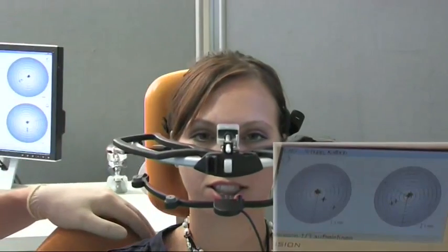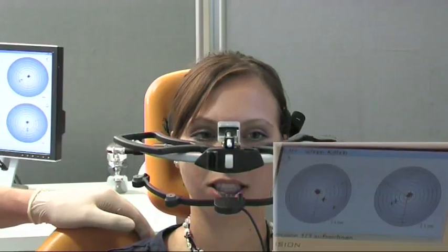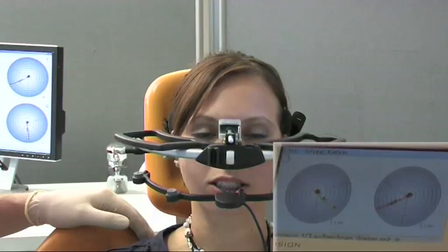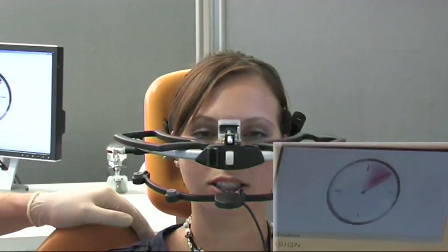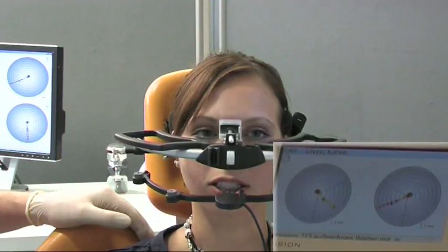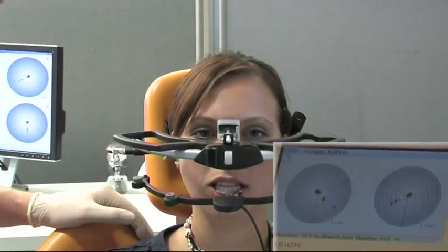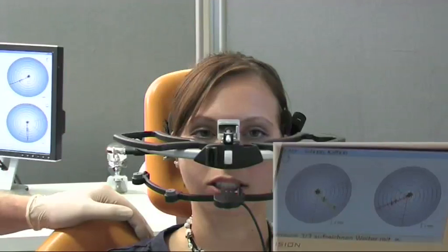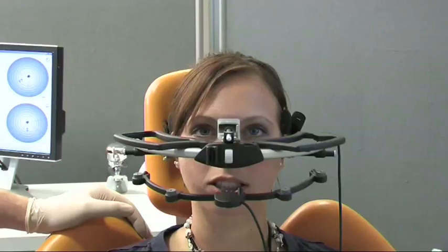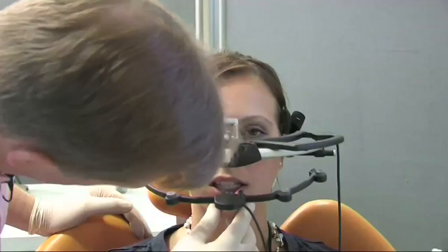Good. Then please look straight ahead. Jaw forward as far as you can and back. And forward as far as you can, back. And forward as far as you can, back. Now move your jaw once more to the left. When you do that, you always go a little to the rear. We don't want that.